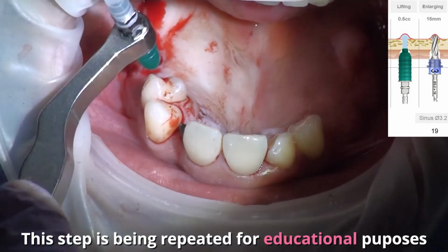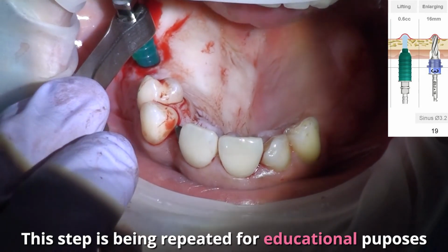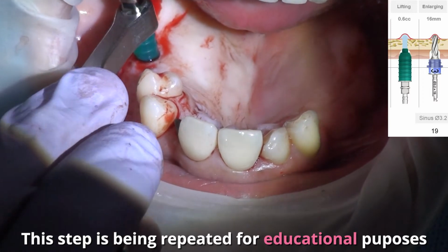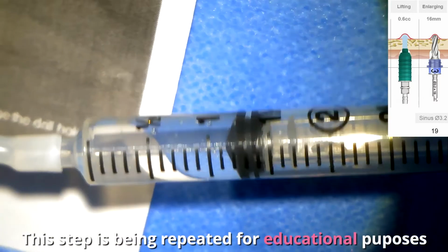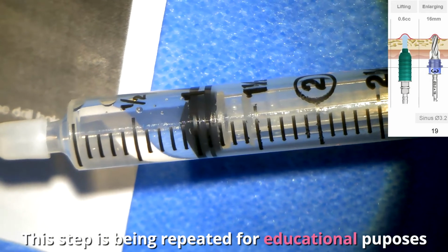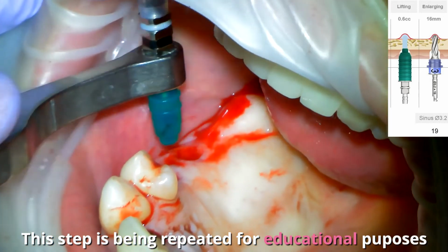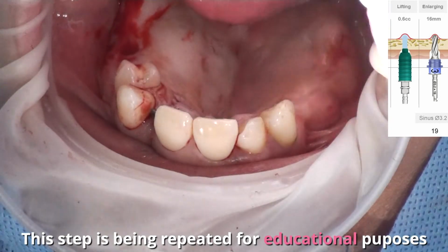I want to just try this one more time because I'd like you to see a more meaningful visual of what we're trying to accomplish here. I think we've accomplished it, but I want you to see it a little better. So again, I create a good seal here. I come back here, and I'm going to push about half a cc worth, a little bit. That's it right there. That's another 0.6. I'm going to go ahead and take that off, and now you're seeing the water run out a little better.